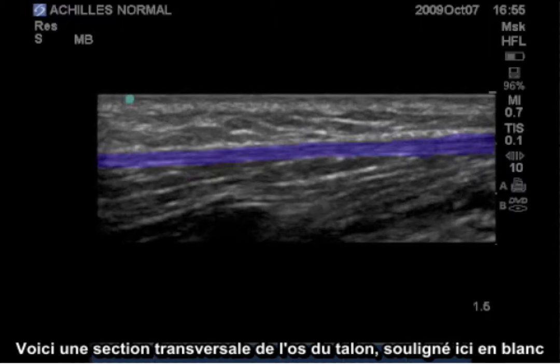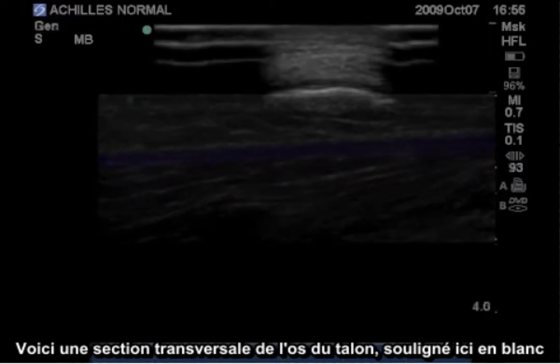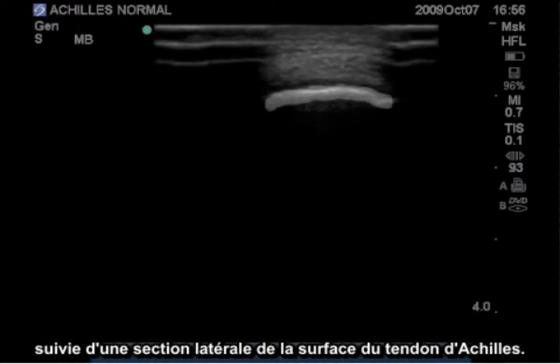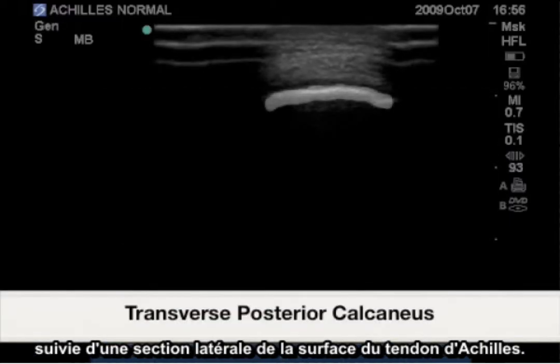Here is a cross-section of the calcaneus highlighted in white, followed by a cross-section of the Achilles tendon superficially.